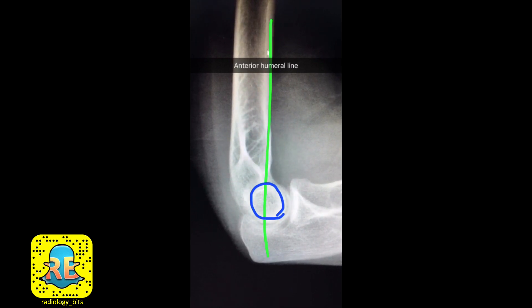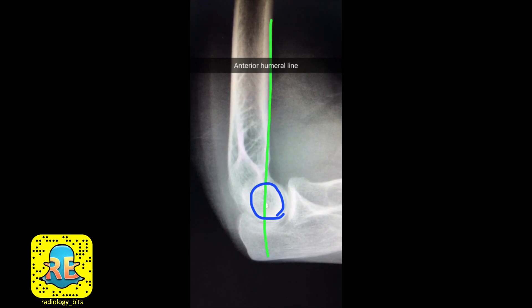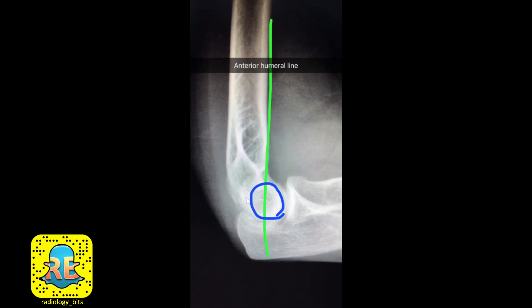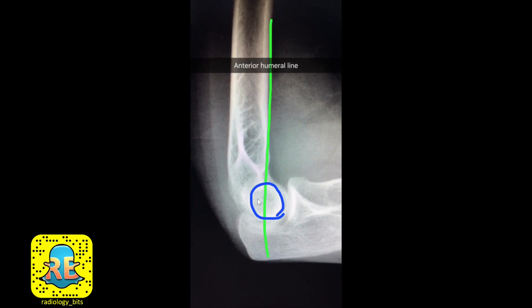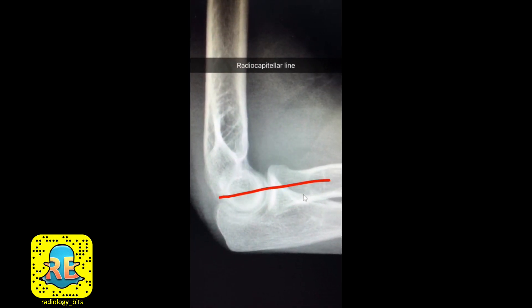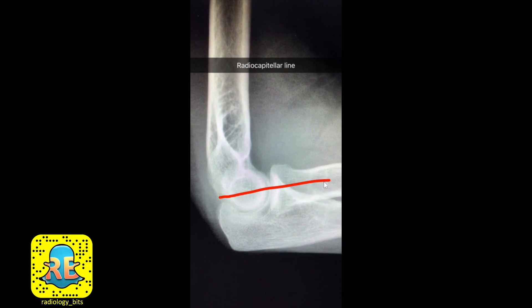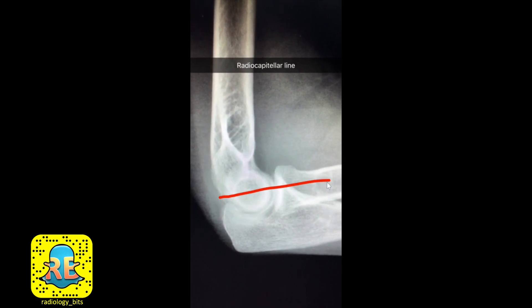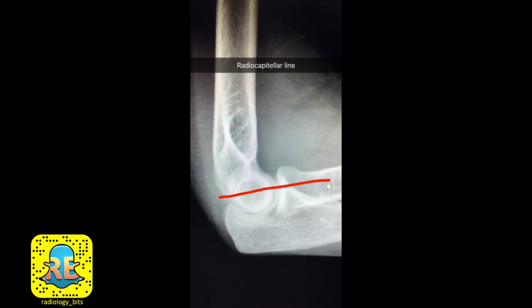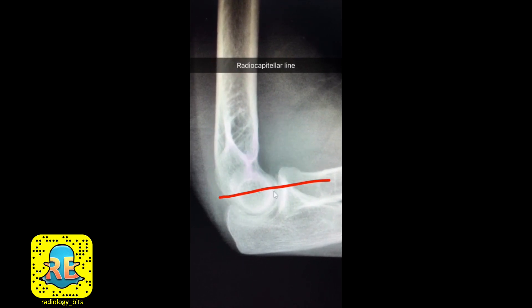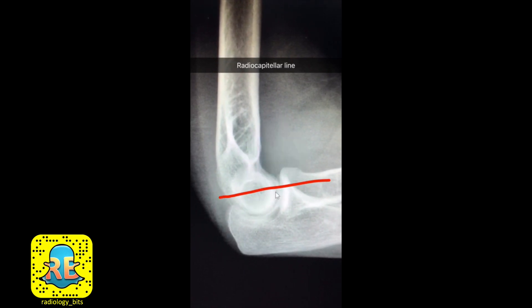Rule number two: if you draw a line along the anterior humerus, this line should intersect the mid third of the capitellum — the rounded structure here. If it does not, that means the capitellum is displaced. Alignment rule number three is the easiest: as mentioned for the frontal radiograph, the radial head should always be along the same line with the capitellum — the radiocapitellar line — maintained in any projection.